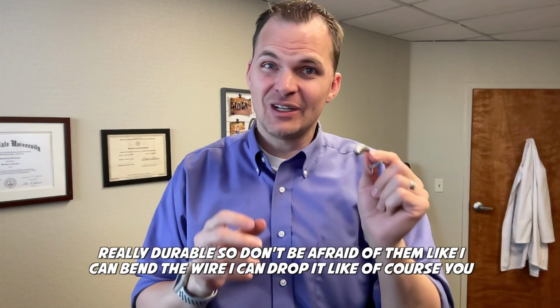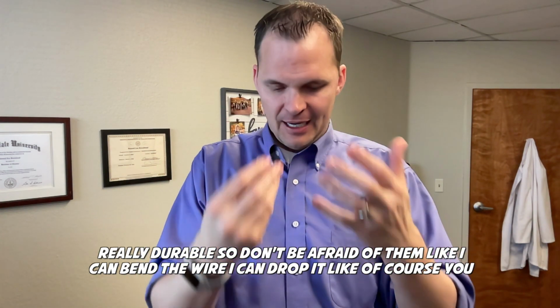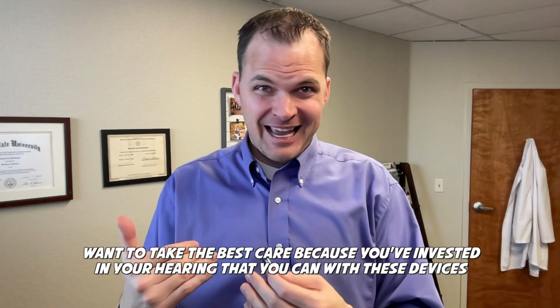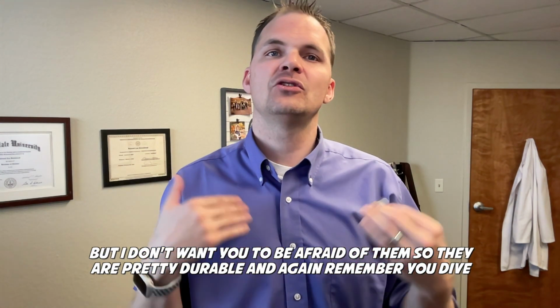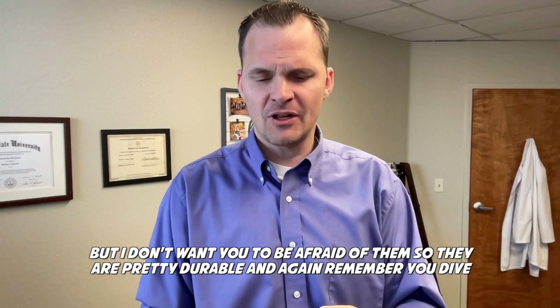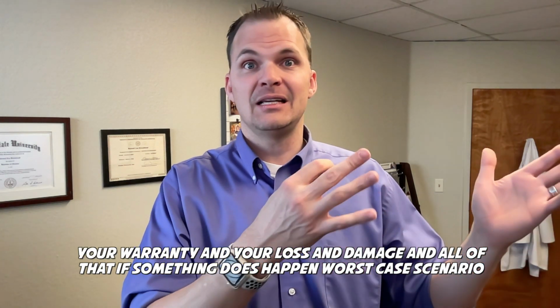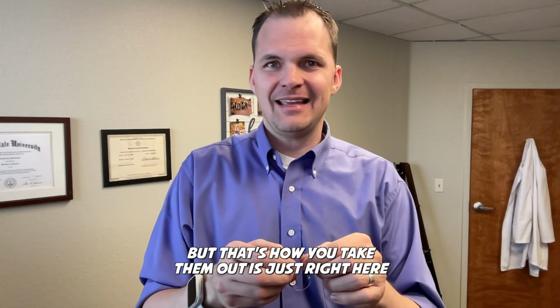Now these hearing aids are really durable, so don't be afraid of them. I can bend the wire, I can drop it. Of course, you want to take the best care of these devices that you can because you've invested in your hearing, but I don't want you to be afraid of them. They are pretty durable. And again, remember, you still have your warranty and your loss and damage coverage if something does happen, worst case scenario. But that's how you take them out.